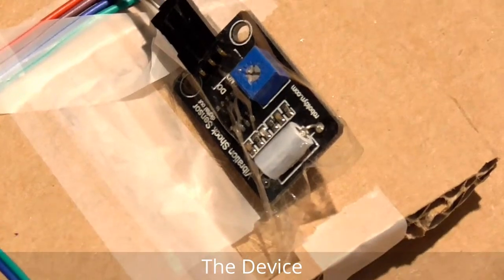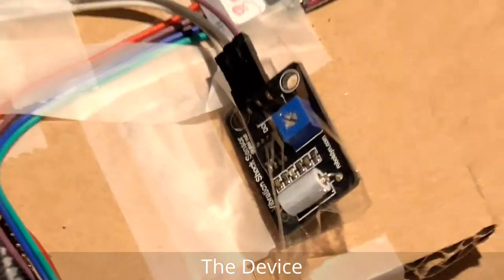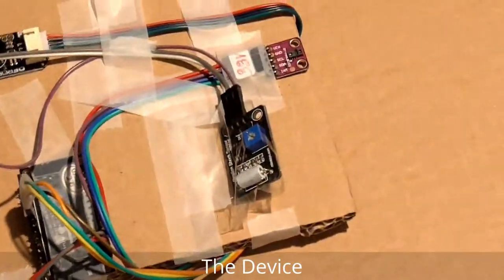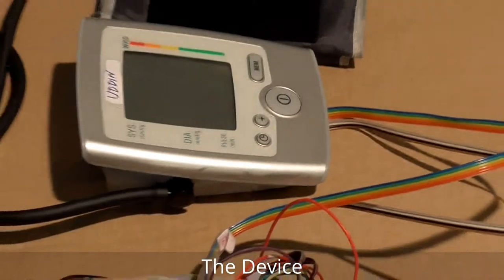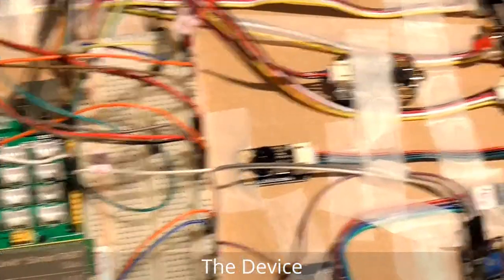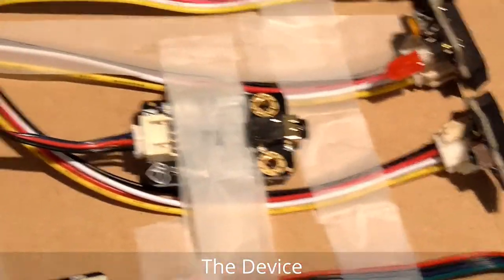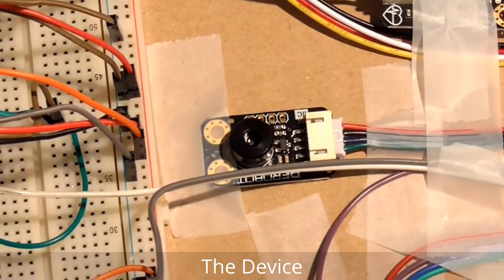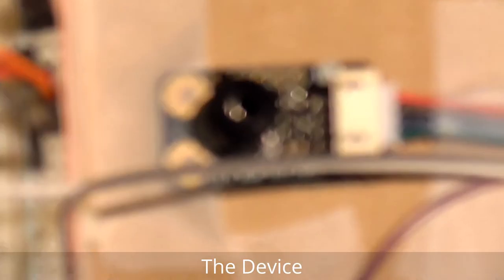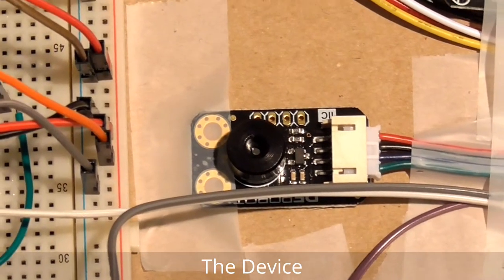This is the vibration sensor — in case of a huge movement, it gives you a notification that the patient is moving. And one more thing: this is the infrared temperature sensor that can measure the patient's body temperature. Since it's infrared, it's really good — you just point it at the patient's body and it can automatically measure the temperature.